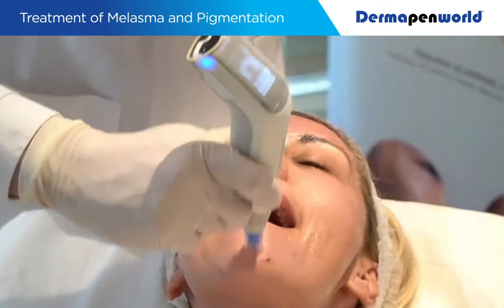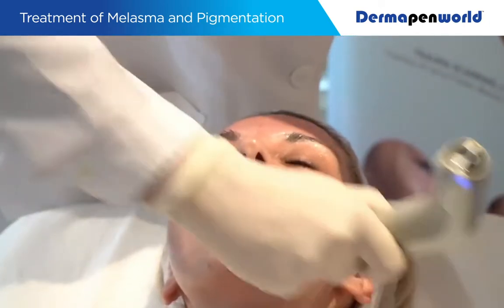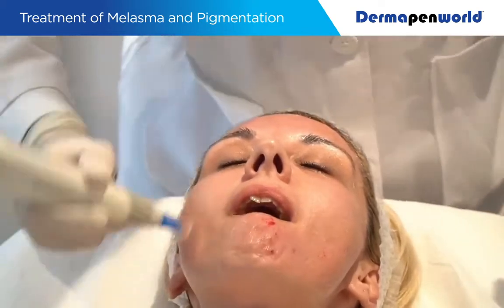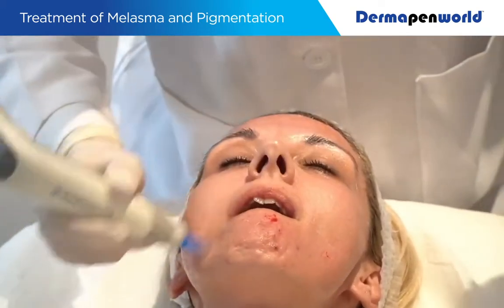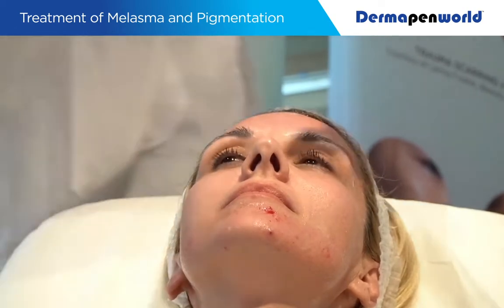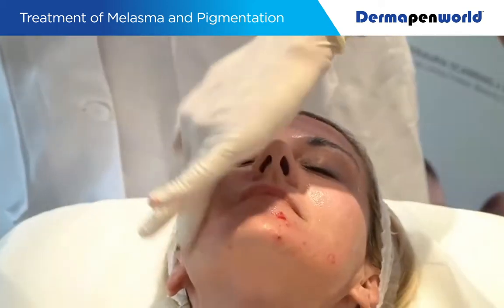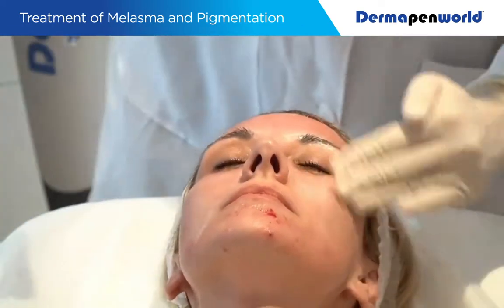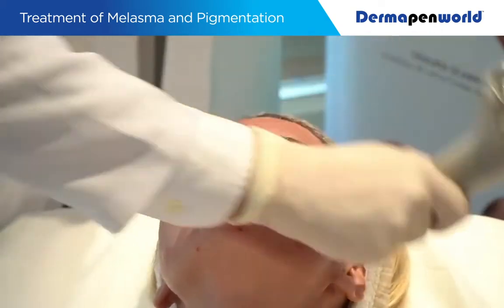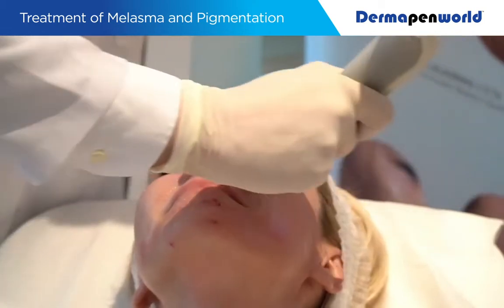So, down, vertical, horizontal, diagonal 1, diagonal 2, other side, vertical, so we're getting some of the occasional pinpoint blood, particularly just on the sides there. Now onto the cheeks. As I gauge around the cheek area, I'm at 0.9. I think if I go any higher, we're going to get too much color. So, vertical. So we're nearly at 1 millimeter. Horizontal. Diagonal 1. Diagonal 2. Done.